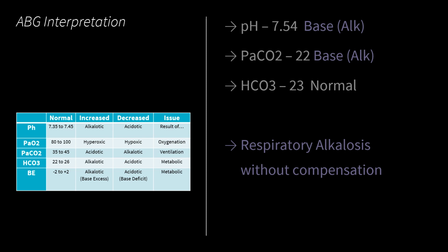This would fit an anxiety attack or some sort of hyperventilation syndrome that is acute and not giving the kidneys time to try and help restore normal pH.